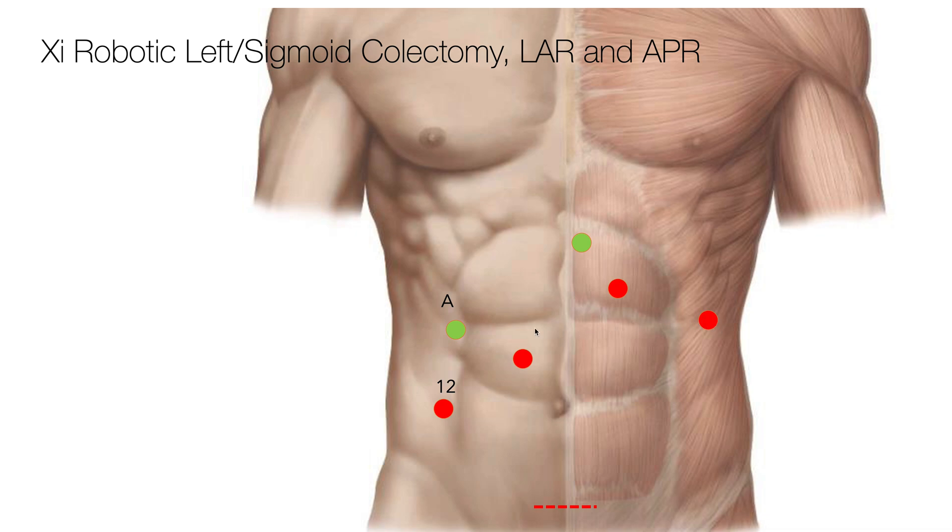I like to use two assistant trocars. I put one in the right upper quadrant — I basically split the distance between these two and come up a ways to try to keep the assistant away from the arms.